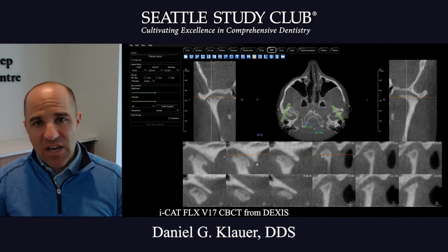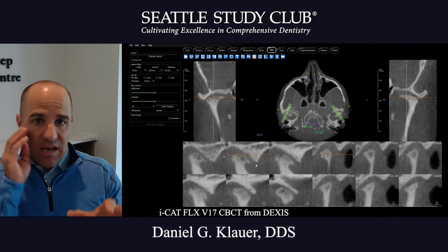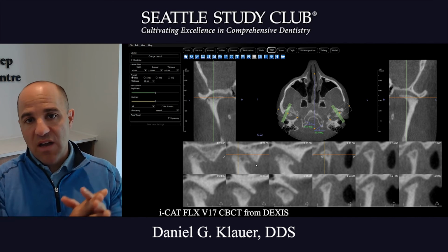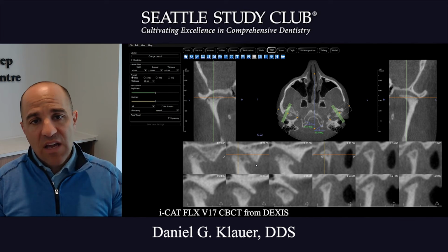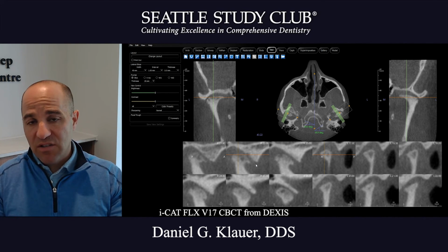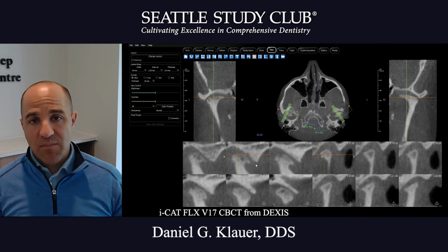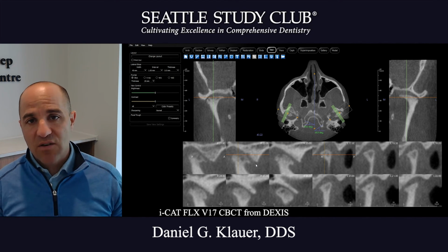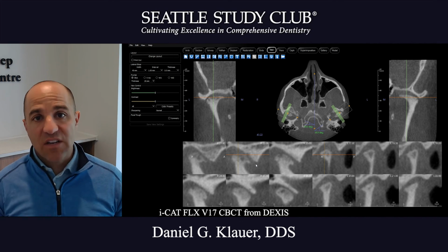And I think the best education, so a tip I would have if you're getting comfortable with this, is take this scan, do your eval, make your notes, and then send it to a CBCT review service radiologist, and then take your report that you made compared with the radiologist report, and that's your best education. And if you can find a service like Beam Readers or some of the others that have screenshots, that's the best, because then you actually see what they're looking at. And so that's a great way to educate yourself and study your scans.